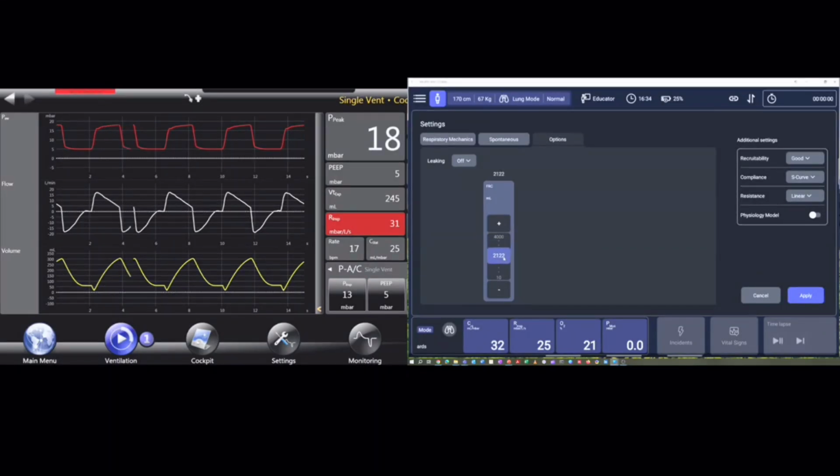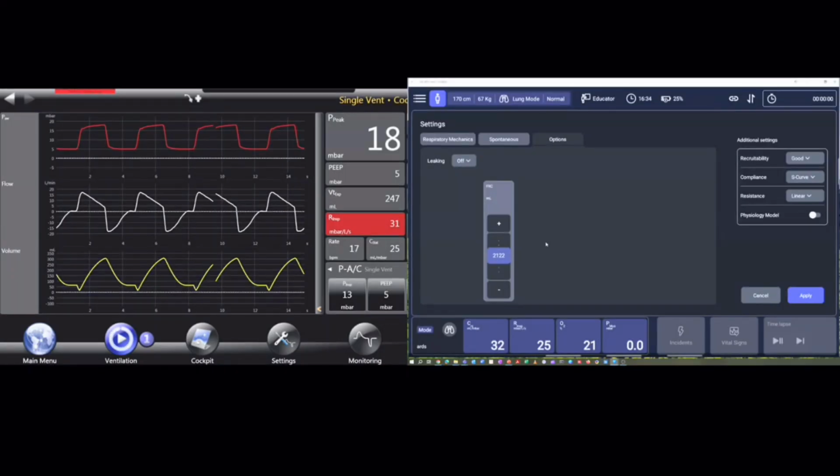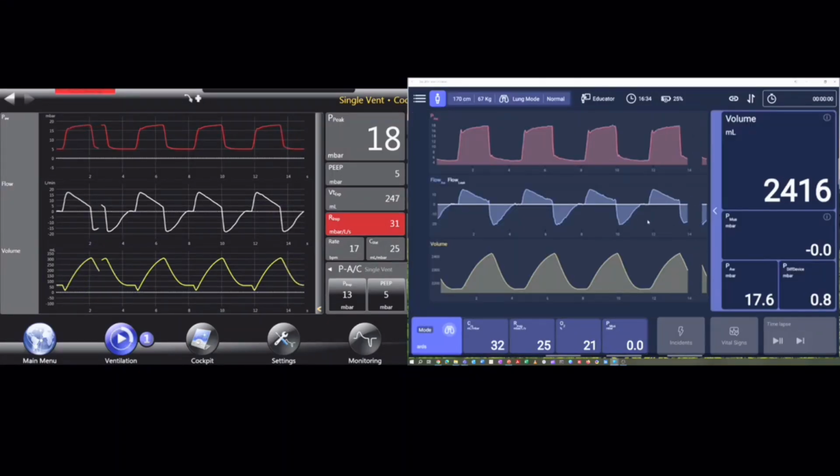And we may increase this later on, because we are not limited to any tidal volume, since we are not conserving the air. We are thinking about this, and we're currently also working with the veterinary university to really simulate large mammals like horses, and then we would also put up the FRC as well. But for a turbine blower, that's not much of an issue. So I apply all these settings.